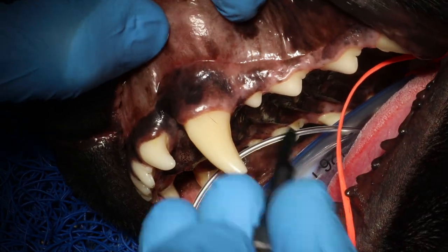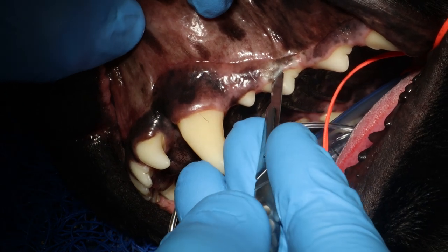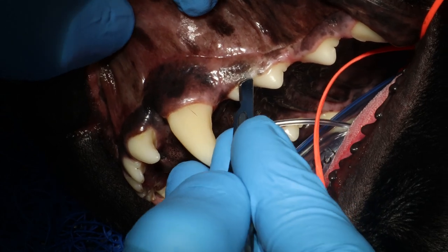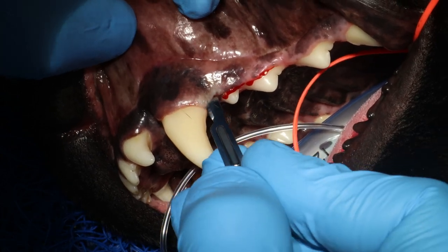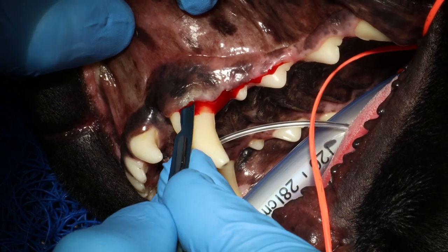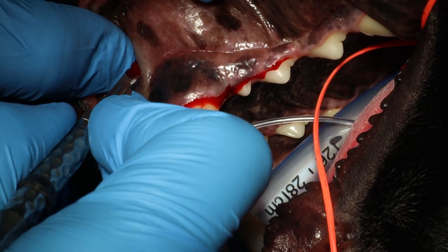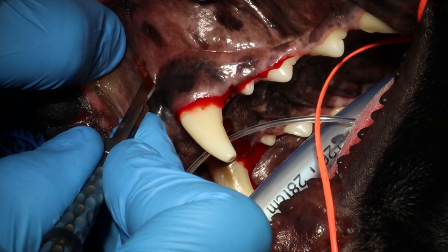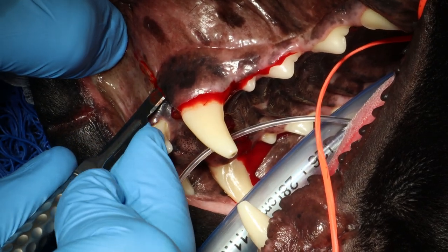This is the extraction of tooth 204 due to a tooth abscess. In this case you want to extend the flap including 206, the second premolar. Now I'm just making stab incisions along the tooth, and here doing a vertical releasing incision that goes all the way from the mucosa and past the mucogingival line.